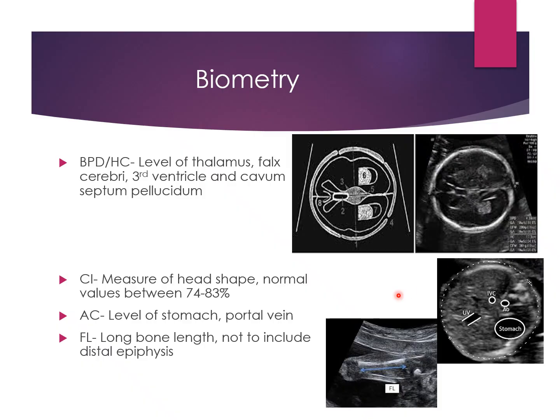So I have here in my picture the area that we are going to be scanning. We have our CSP, it's going to be in the front of the head. Then we have our 3rd ventricle, and either side of the 3rd ventricle we have our thalami, and then you may or may not see the choroid plexus coming in the posterior horn of the lateral ventricle. It's not a huge deal breaker if you see them slightly.